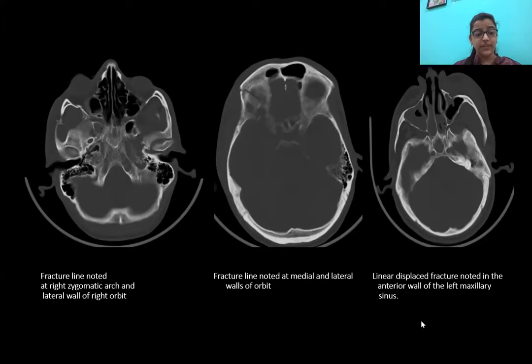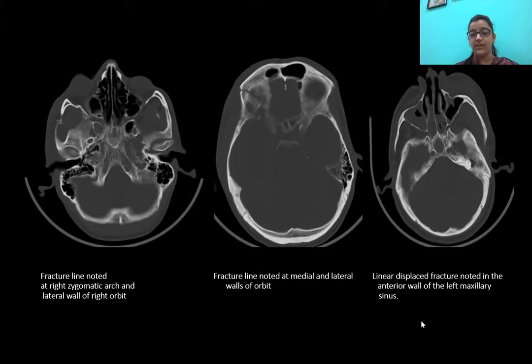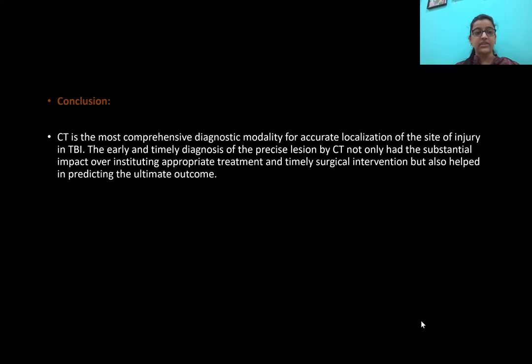These images show a fracture line in the right zygomatic arch and lateral wall of the right orbit, and a fracture line in the medial and lateral walls of the orbit. The next image shows a linear displaced fracture in the anterior wall of the left maxillary sinus. The following images show some hemorrhages.